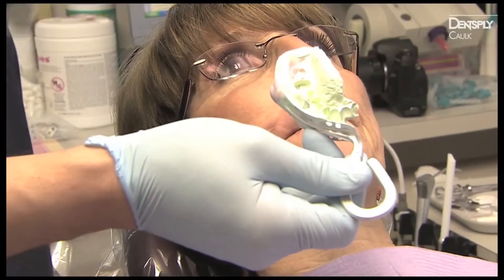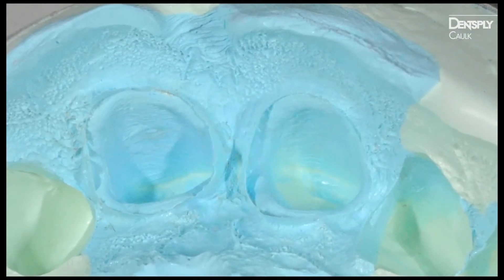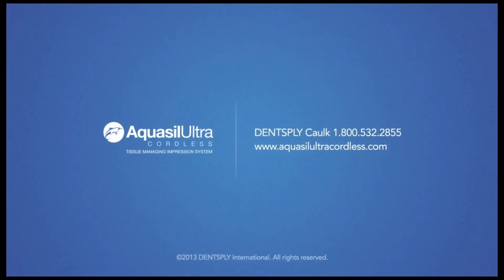Remove the tray after 3 minutes for a single unit, or 4 minutes and 30 seconds for a multi-unit. Enjoy a perfect impression every time without the use of cord or retraction paste. With new Aquasil Ultra Cordless, impression making will never be the same.